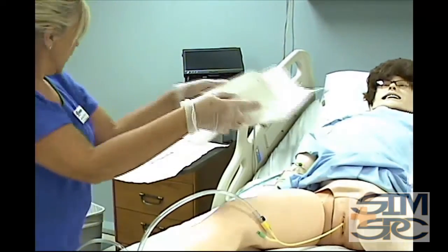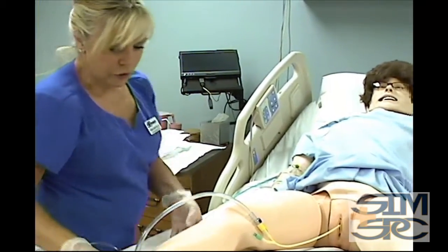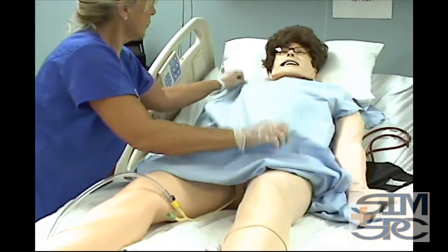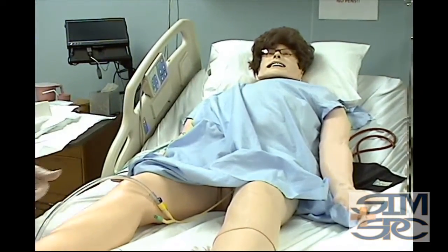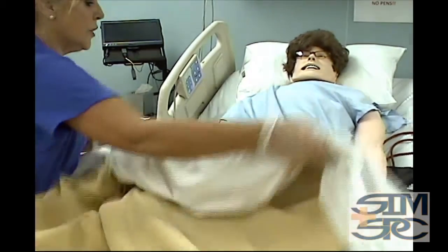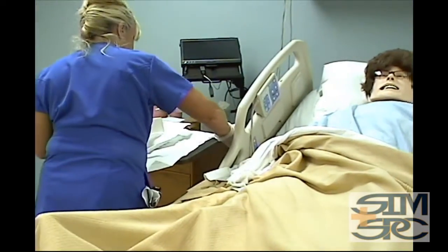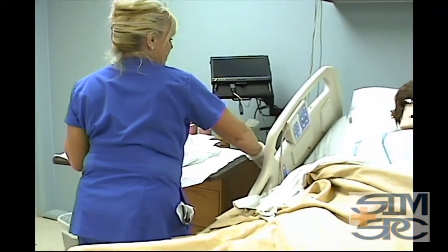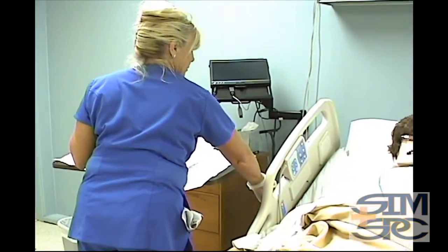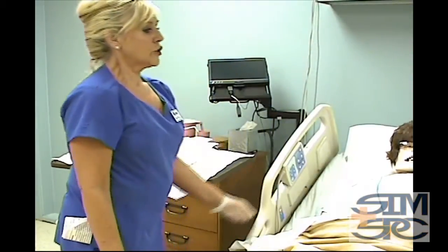So now we're through. We've cleaned the patient. We can move this. We can move this. Go ahead and get the patient comfortable. Position her again. Your gown down. Now what we're going to note to see how much urine we get, we're going to see that the urine is still flowing. We're going to go ahead and cover the patient. Get her in a comfortable position. We're going to lower her bed for safety. Okay. And we're going to make sure the side rails are still secure enough. Make sure the bed is locked.